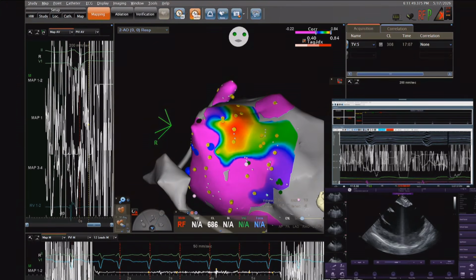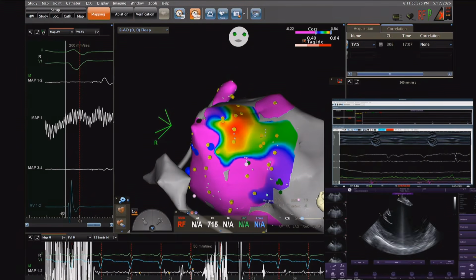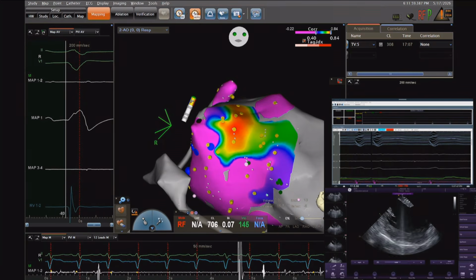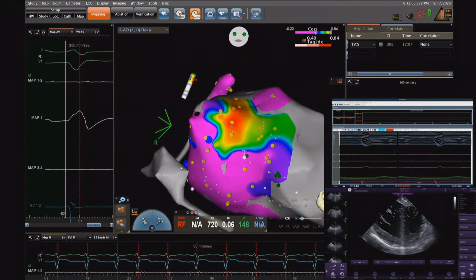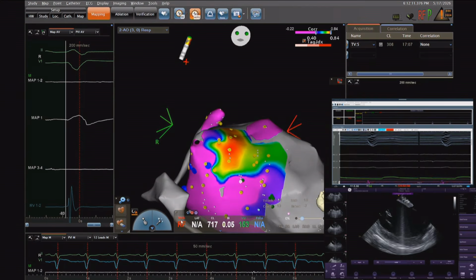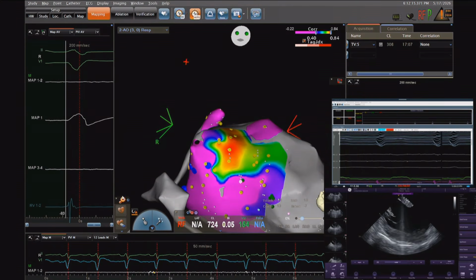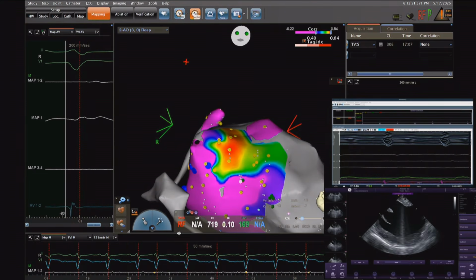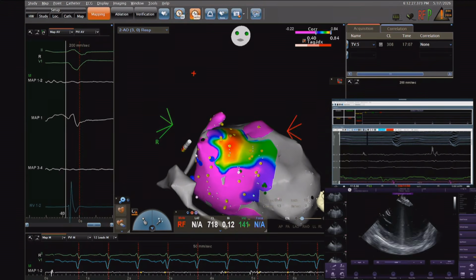Okay, so we can go now to the right cusp. I guess there was also no QRS delay in this red region during pace map. There was some small, but not particularly. Yeah. Much bigger delay was in the apical aneurysm, obviously, because there is a big scar. Let's go back to the cycle length. The cycle length is extremely short, so we really don't expect too much. The induced VT heart rate was 260, which matches the spontaneous VTs in these patients.